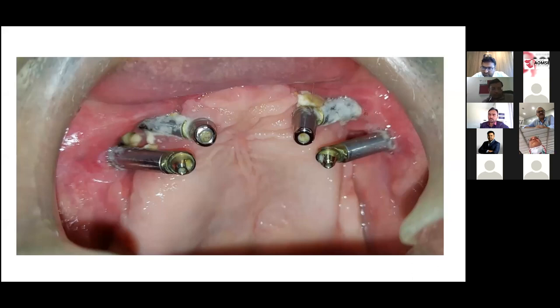For this particular patient, I have very limited experience with zygoma, but what we do in PSI is we superimpose the soft tissue also. We apply a radiopaque gel on the palatal surface, and then you take a CT scan. Then you superimpose the cast on the same thing, so you get the exact palatal height. And then when you decide the length of the zygoma, I think you may overcome this problem of the long shafts exposing inside.